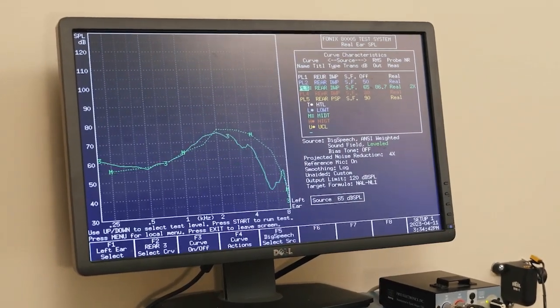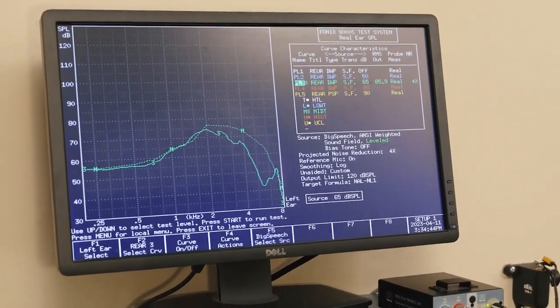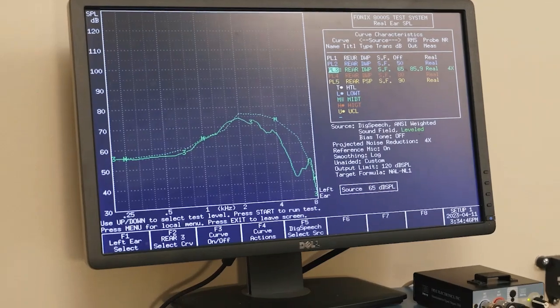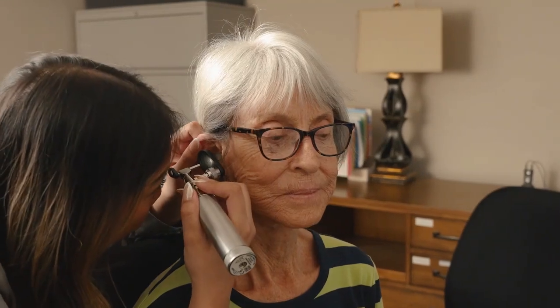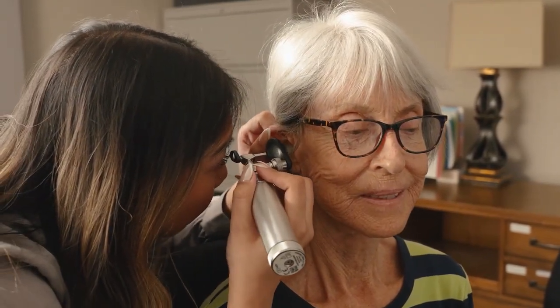However, what initially comes out of the hearing aid, or what we call the first fit, is rarely what is needed by the patient. Each ear canal has its own acoustic environment. The canal has its own size or volume. Physical properties such as skin, bone, fat, and cartilage can be different as well.